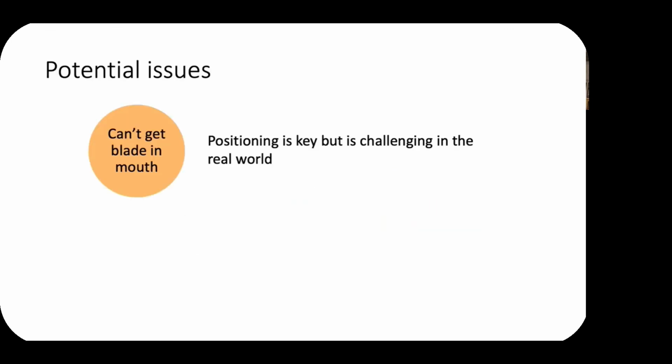Hopefully understanding the effects of different positioning maneuvers may help you reduce the likelihood of you experiencing laryngoscope insertion difficulties. I'm very conscious, however, that translating them into the real world is challenging when the patient also requires lateral tilting and you are having to convert to GA mid-caesarean section.